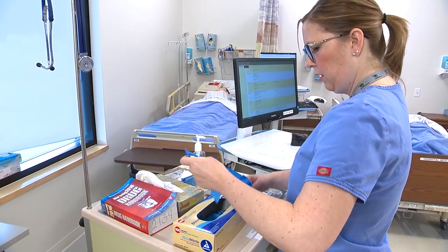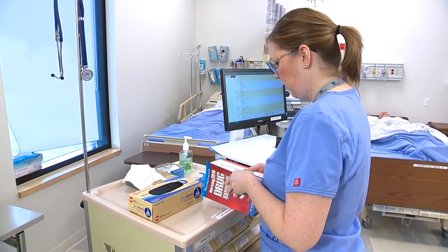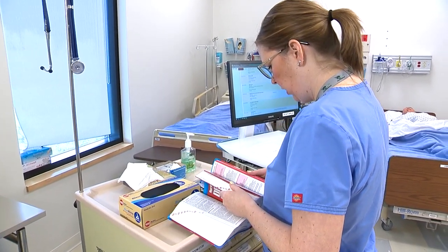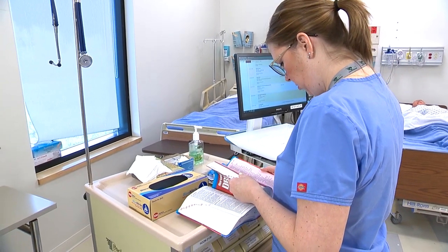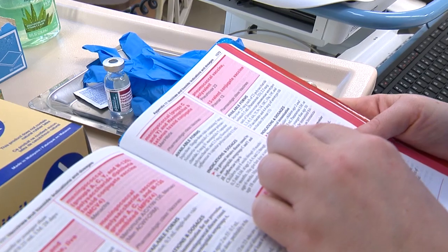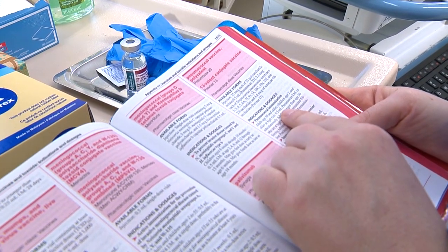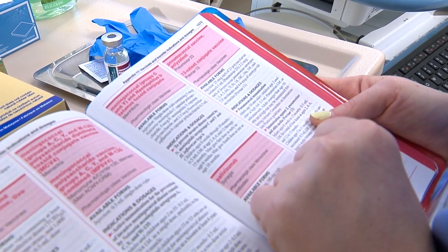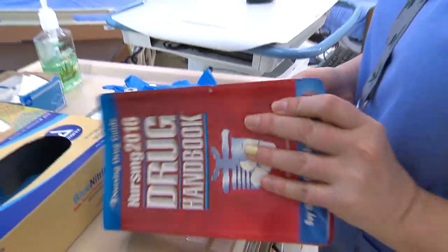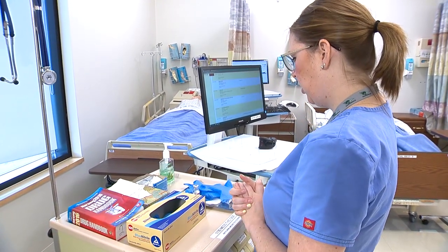I'm also going to look up the medication in the drug book to check for any sensitivities or issues, though I see he has no known allergies. I see I have the pneumococcal vaccine — it can be given by injection. Adults 50 and older, and children age 2 and older at high risk, receive 0.5 mL given IM or sub-Q. The only reason I would hold off would be if my patient had a fever or an allergy to the vaccine.